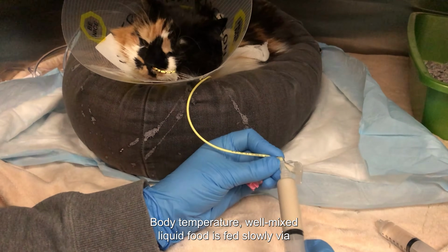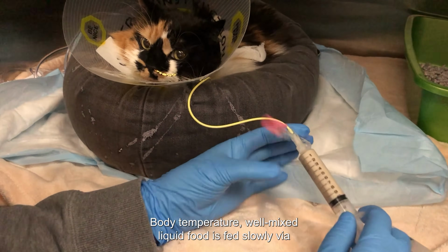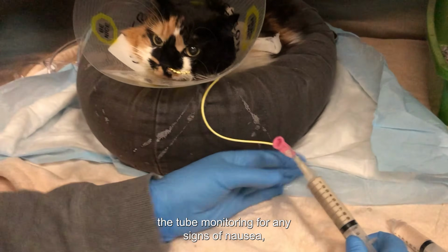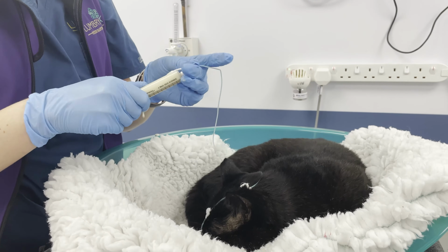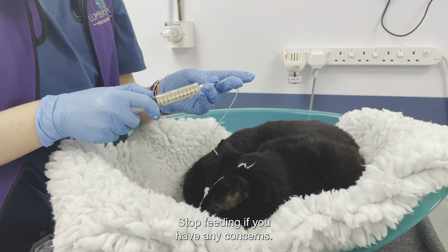Body temperature, well-mixed liquid food is fed slowly via the tube, monitoring for any signs of nausea, restlessness, or cough. Stop feeding if you have any concerns.